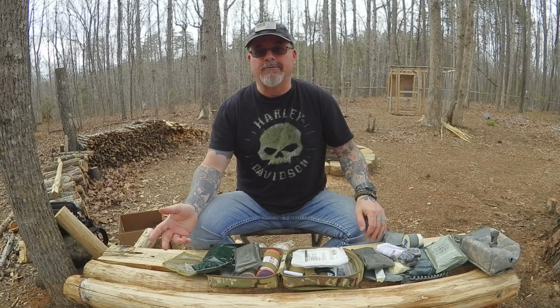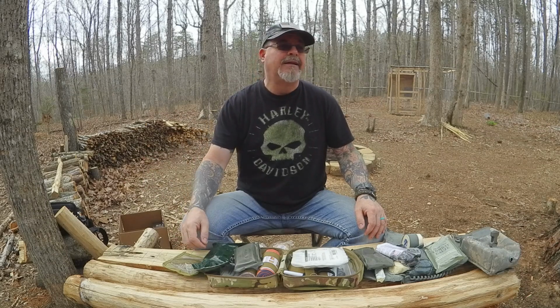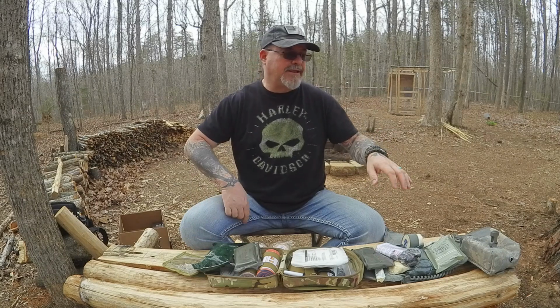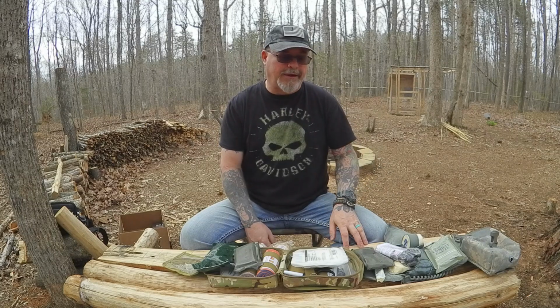I'm not going to sugarcoat this and say that this kit is going to be the end all be all thing, because there isn't one. Not unless you're carrying a big combat pack that our combat medics used to carry. It's not going to do it. These are used to treat major triage, big injuries, to stop the bleeding, to get you to help. These things are designed to stop that bleeding, get you medevaced out to wherever you need to go, to get you to hospital so they can treat you properly. And these IFAK kits, that's what they're designed to do.